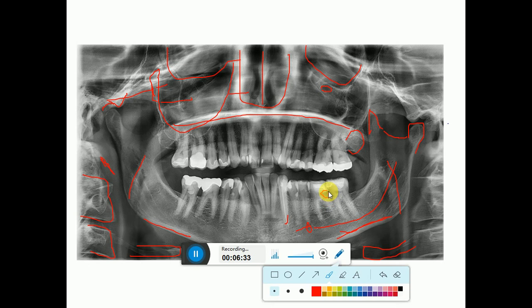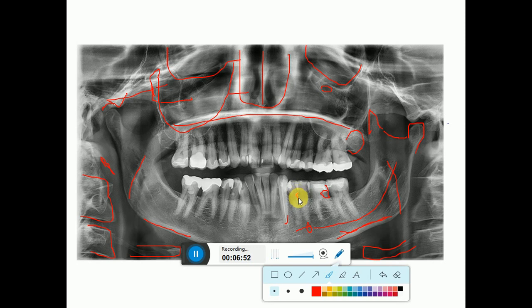It looks like caries here in the tooth structure. For individualized tooth assessment, if you want a better picture of individual teeth, you can go for a periapical x-ray or bite wing x-ray. This is a caries tooth, and you can see there is also a restoration here due to cervical caries.